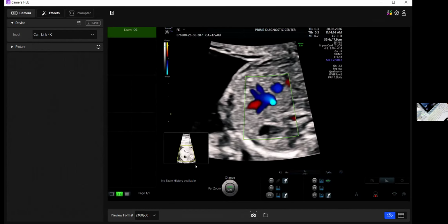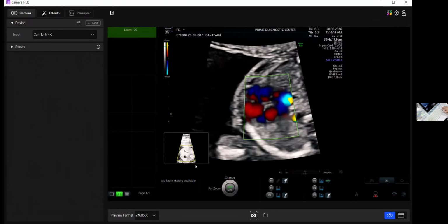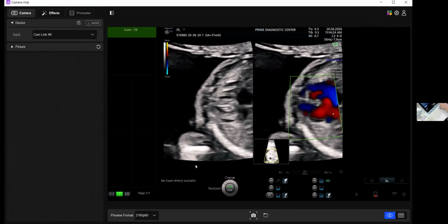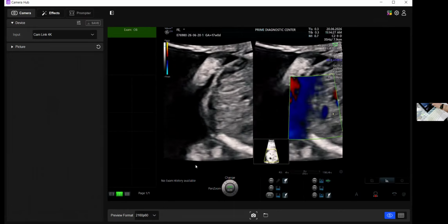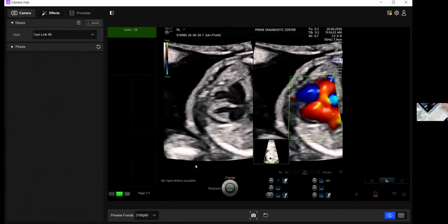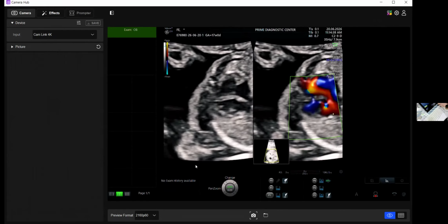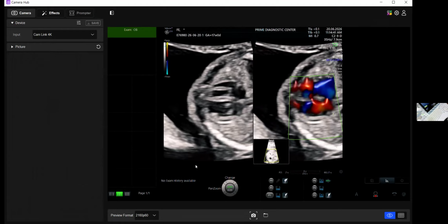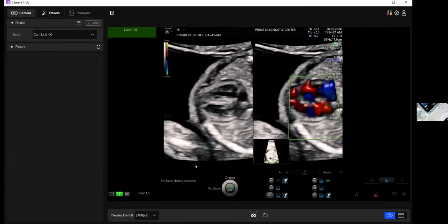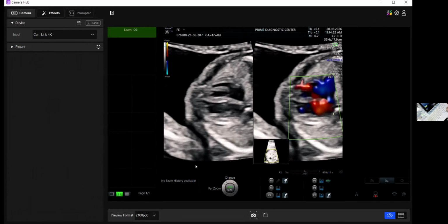Okay. So now we move to the head is down, that we've confirmed, and maybe let's do the hunting for, we are on the low PRF setting anyway, and then I gradually reduce the gain settings. So now gain is reduced. Now I can look for a VSD. Many a times you do see few tweaks going up and down, but if they are not consistent, they generally are not a sign of a VSD.